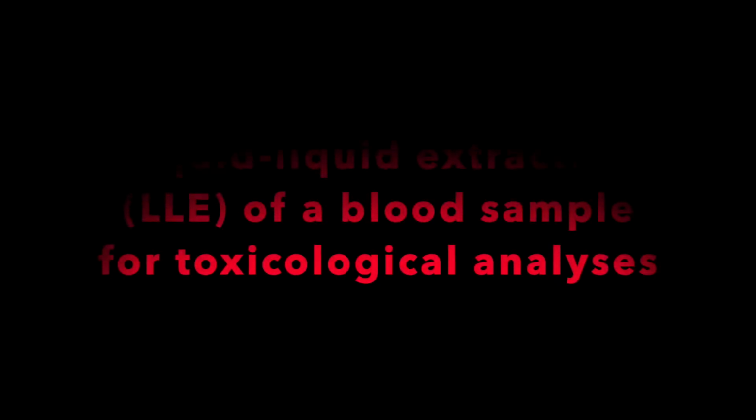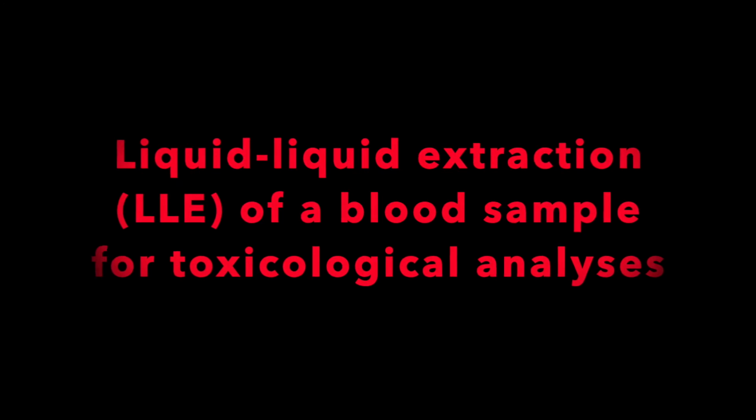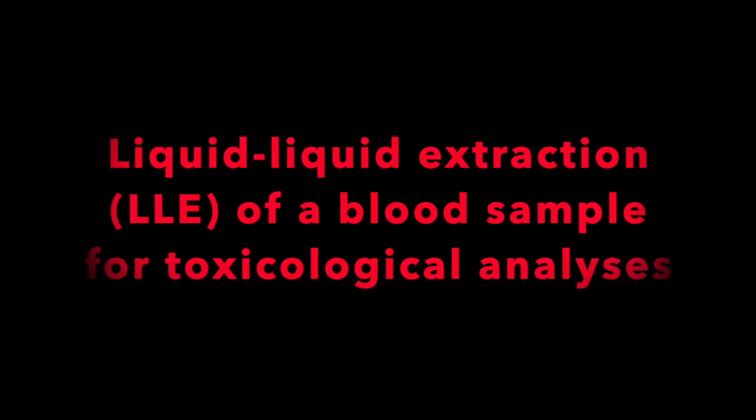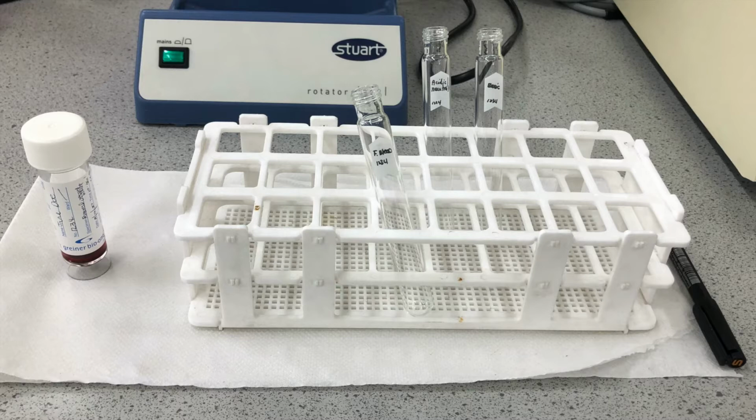Let's now look at the liquid-liquid extraction of a blood sample for toxicological analyses. First, what we're going to do is prepare a workspace by having the blood sample. We're also going to have a test tube holder or test tube rack and our labelled test tubes.